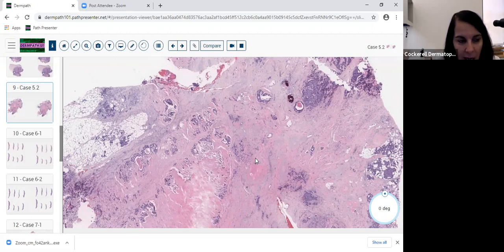for metastatic breast. And the gross cystic disease fluid protein, don't forget about that one. That's another one. And mammoglobin. Mammoglobin can be positive with adnexal, but it'll be focal staining, it'll be scattered. So those are some of the stains you can do to prove that it's breast.